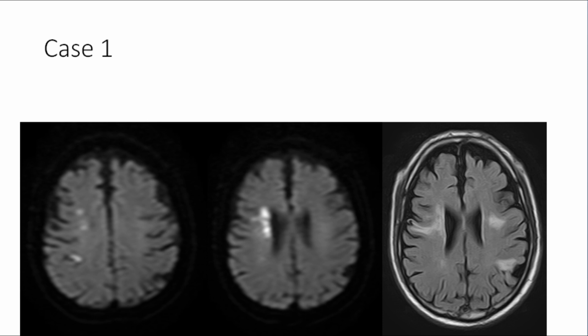Have you ever heard of watershed stroke? This is a watershed stroke. How do I know that? The appearance of it, you see there are multiple small changes or hyperintensities, and then what we call the string of beads, that's the appearance of it. So the first part is a watershed stroke. Okay, what should be done next? That's a question from a clinician, from a neurologist. But the radiologist should know that.